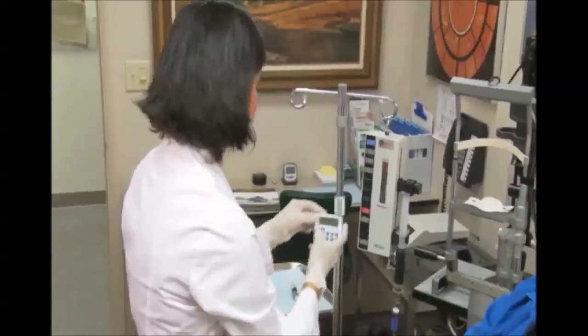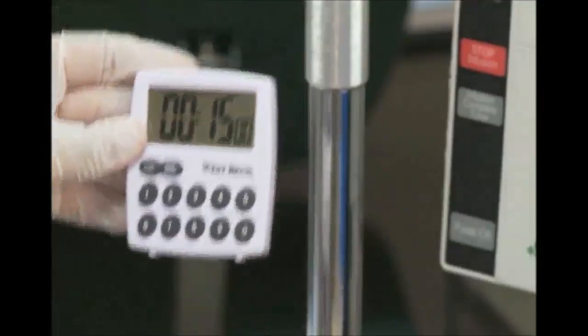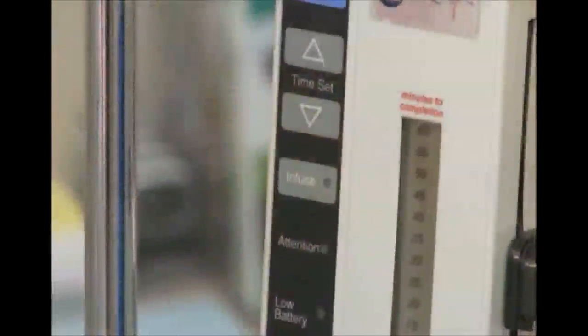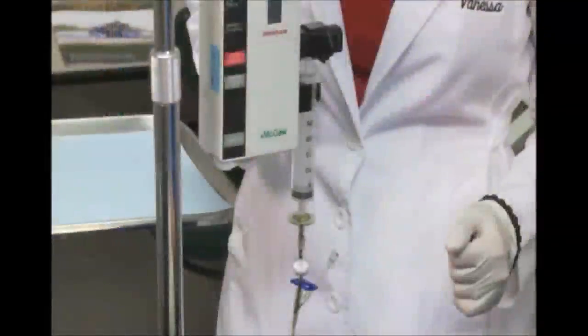Then set a separate timer for 15 minutes. This timer is used to indicate the start of the laser treatment, which begins at the end of the 15-minute time period. After 10 minutes, the Visudyne infusion will be complete and the pump should be turned off.